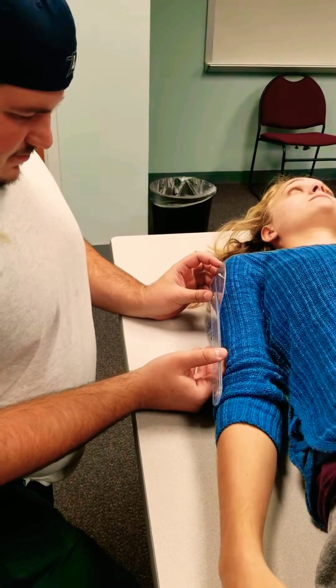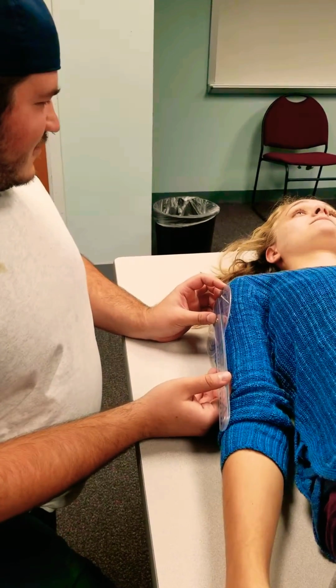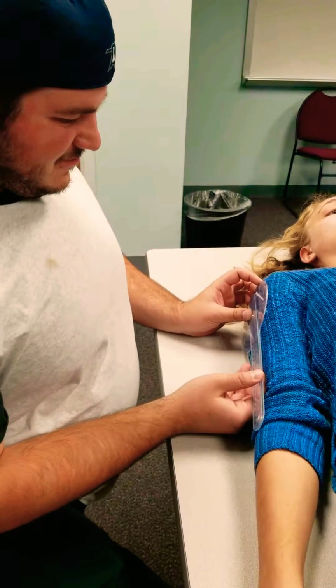Today we are doing shoulder goniometry. We are measuring the glenohumeral range of motion both actively and passively. The first movement we're going to do is flexion of the shoulder.